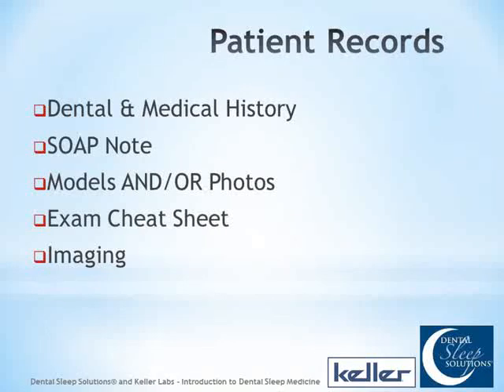Just to make sure I understand you, Rich, you take pictures of the study models themselves or of the patient? We just take pictures of the study models that we take of the patient. What we do is exactly the same thing, except we take photos of the patient themselves, basically the same pictures you see here. I think it's a good documentation of bite prior to treatment and all the things that Rich said.